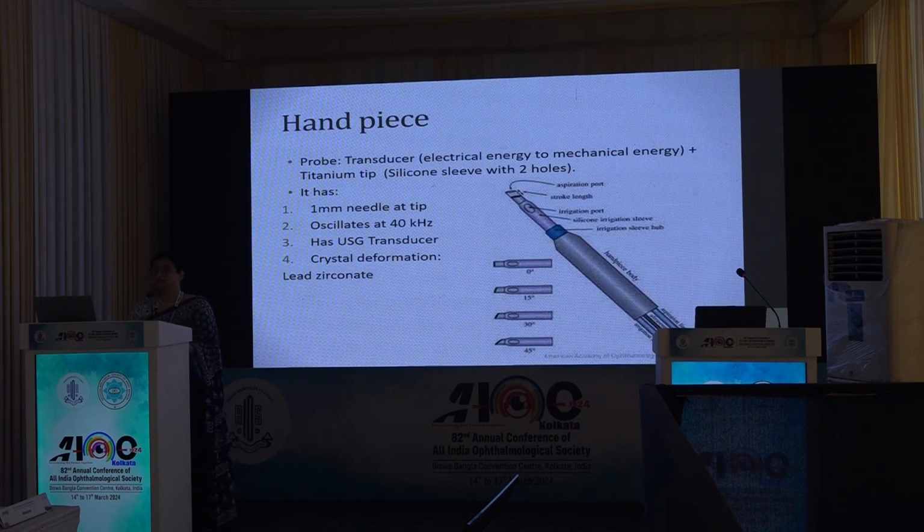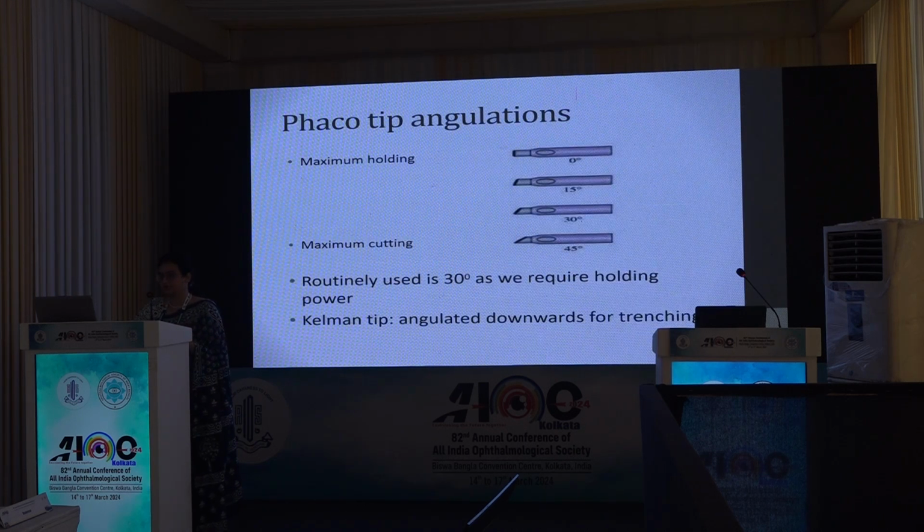We have a phaco probe which has a transducer that converts electrical energy to mechanical energy, and it has a titanium tip, which is covered by a silicon sleeve. It has a 1 mm needle at the tip and oscillates at 40 kHz. It has an ultrasound transducer with lead zirconate crystals present, whose deformation leads to the generation of energy. Now the phaco tip has various angulations from 0 to 45 degrees.